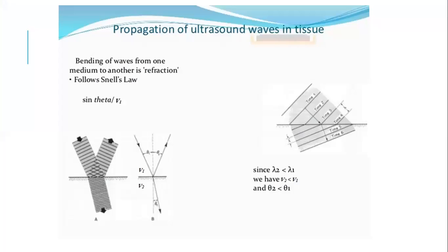In this slide, we explain Snell's law. When the wave beam transfers from one medium to another medium, the velocity is changed, and also the angle of incidence is different from the angle of refraction.